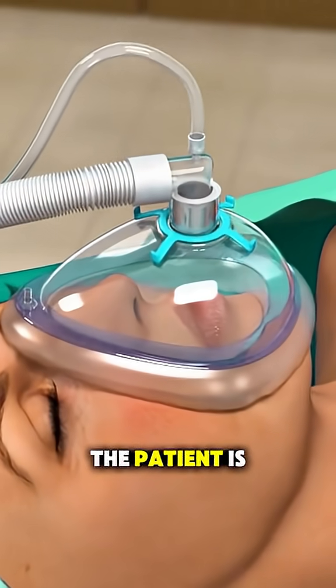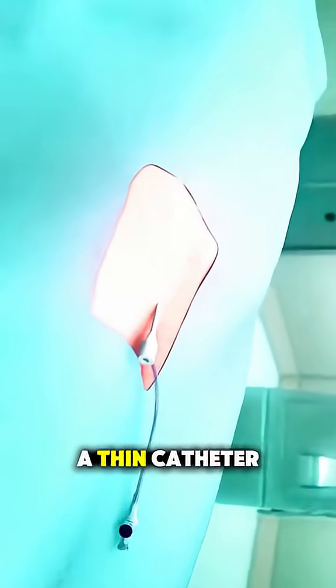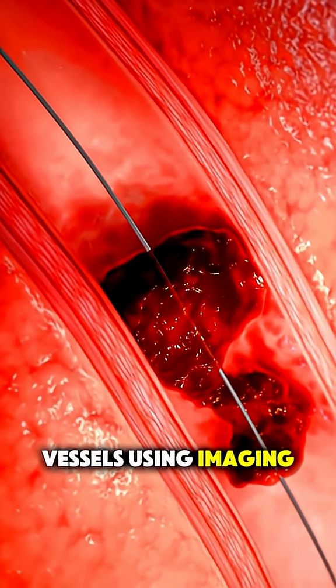First, the patient is given anesthesia, and surgeons insert a thin catheter, usually through the groin or arm, and guide it through the blood vessels using imaging like x-ray.